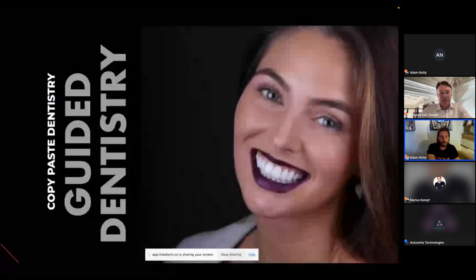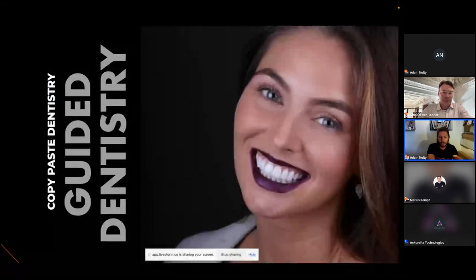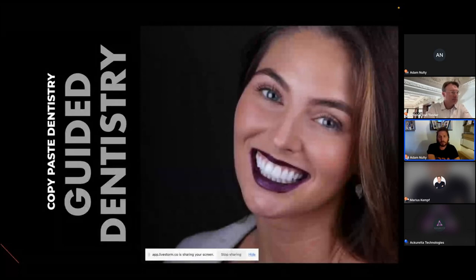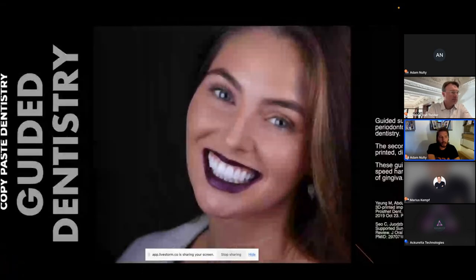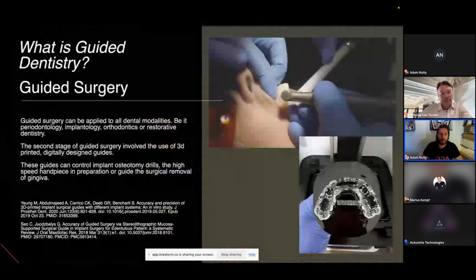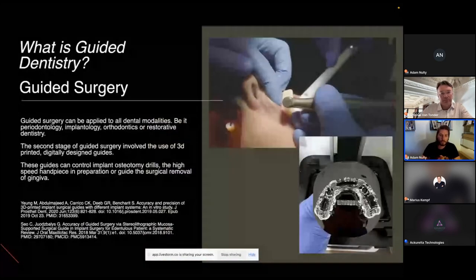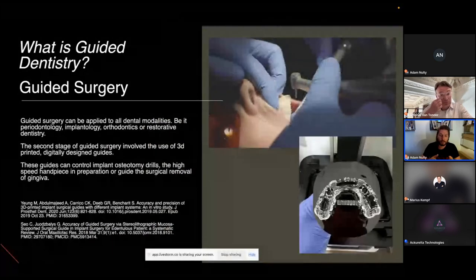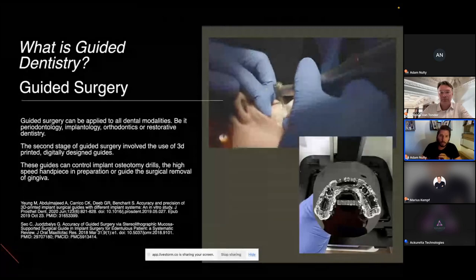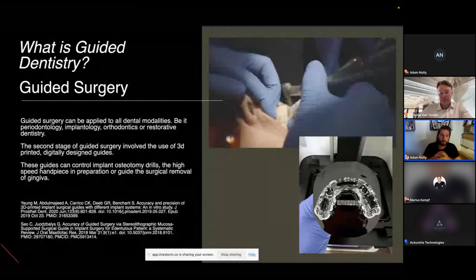So how can we use it for the ideal situation? Well, a case like this, guided dentistry, something which Christian's going to talk about on the DSD day, where realistically, we want to be able to guide every step of the way, not just the consent process, but we want to guide their preparation. So we're going to use either a direct or an indirect mock-up to guide that preparation process.